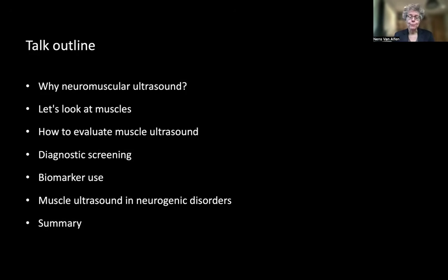Remind you, this is a very brief presentation, so if you want more details, there's more formal training to be had, and I will show you where to get it at the end. And finally, we're going to take a look at muscle ultrasound and its use in neurogenic disorders such as ALS.